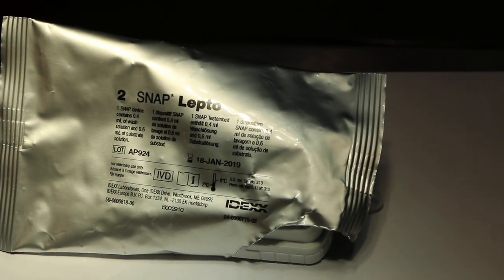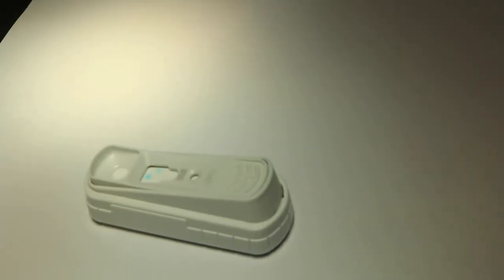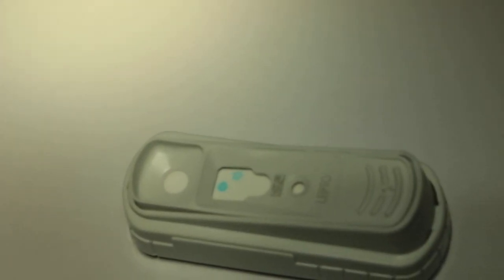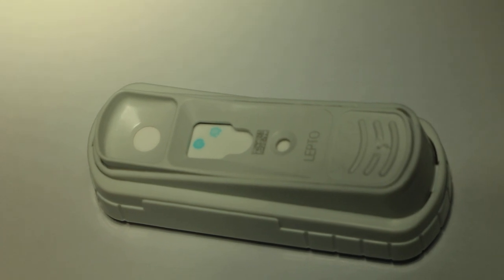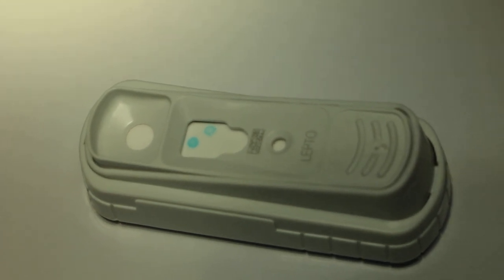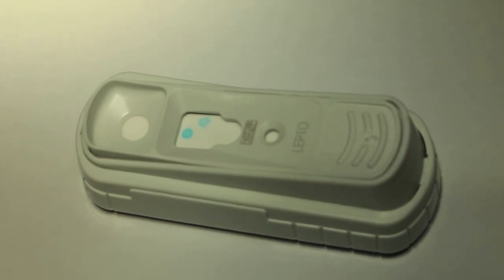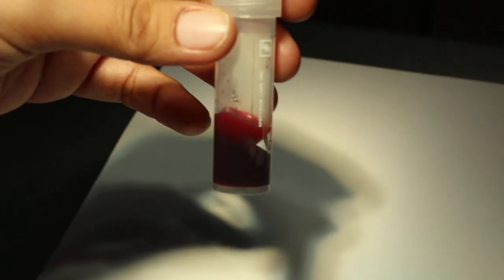You can only open the container when you're going to use it. Take it out half an hour before — they are from the fridge. So this is the SNAP test for lepto. We collected blood and wait for it to coagulate to collect the serum.